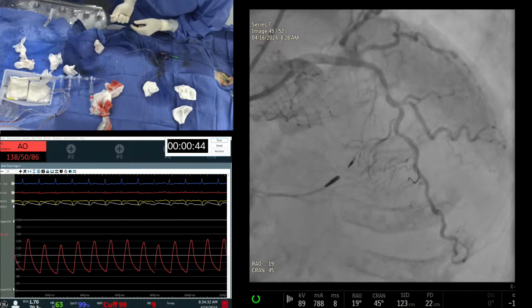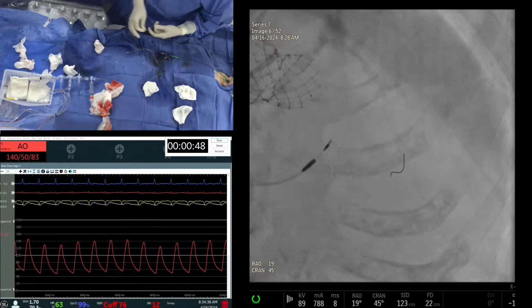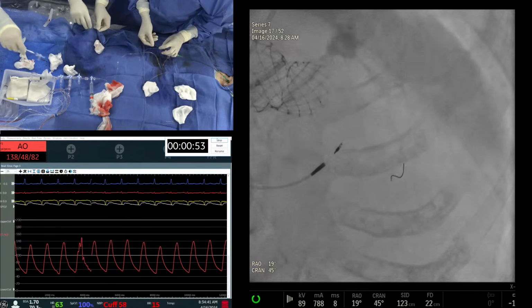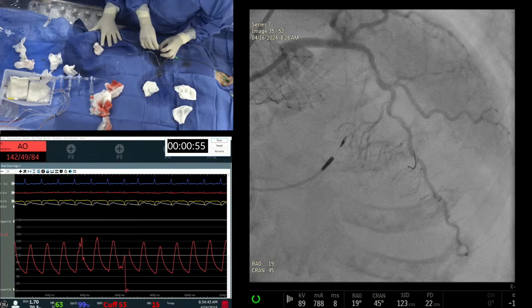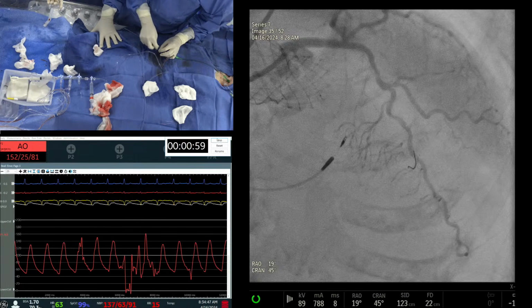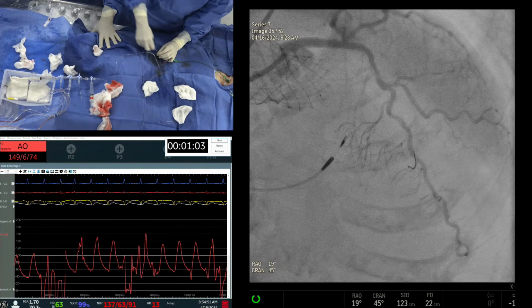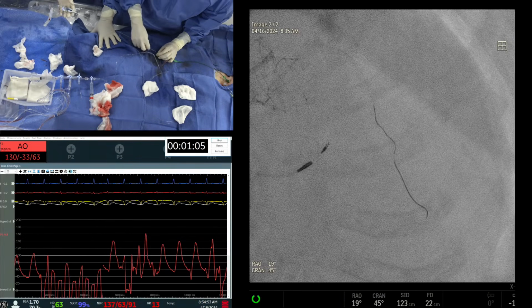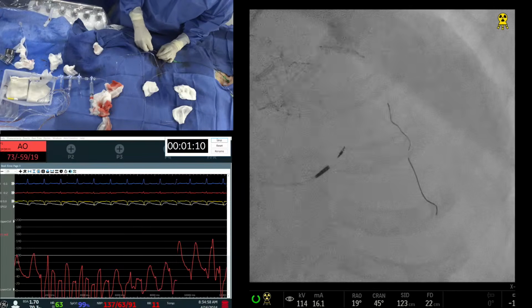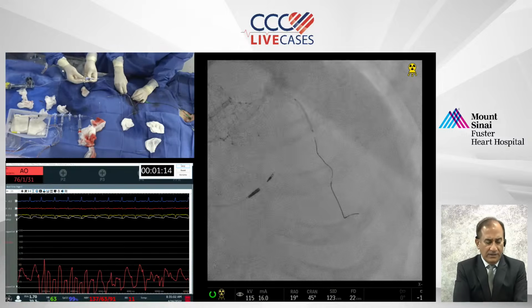This one, even Synergy with the thin struts may still have trouble going in because of the calcium in the proximal. So there's no disease proximally, angiographically I mean, but it is calcified. So this may have trouble delivering the device. And that's what we say: calcium is not only at the lesion, not letting your lesion expand, but delivery of the devices may also be hampered.